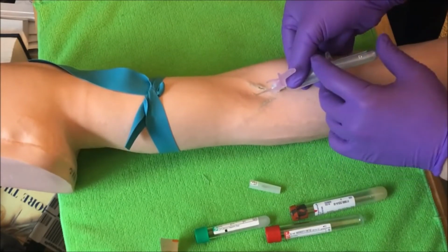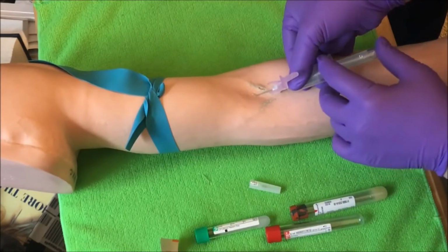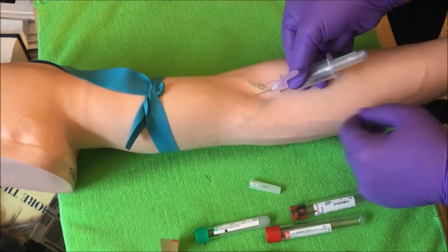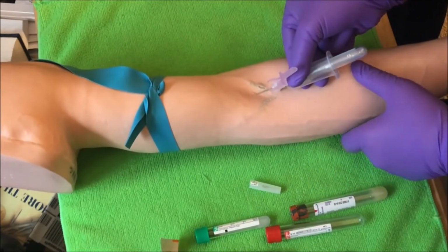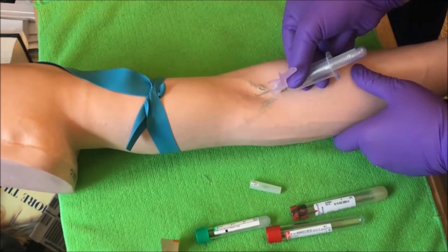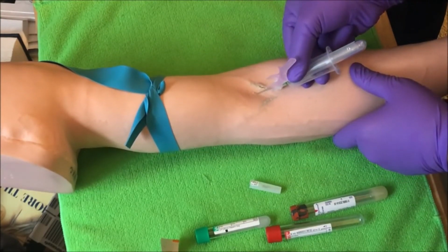And so when I push in with my 2 fingers and my thumb behind the tube, 2 fingers on these little phalange grips, push in, and I should get blood flow. I can see it squirting in. If it's not, then the only thing I need to do, the only adjustment I can make to this needle, which is again on my other videos, is either going a little bit deeper, or if I think I went too far, pulling a little bit back.